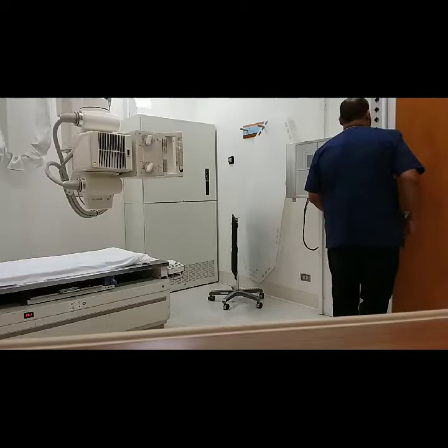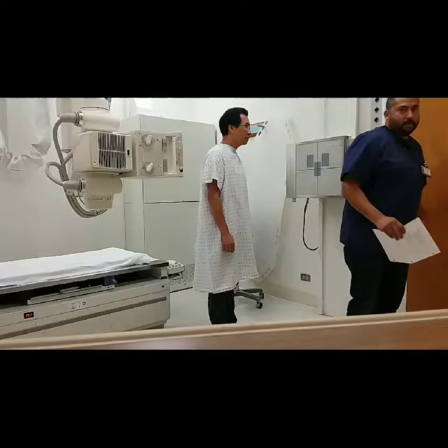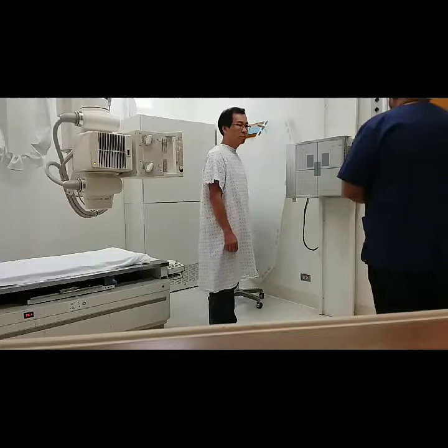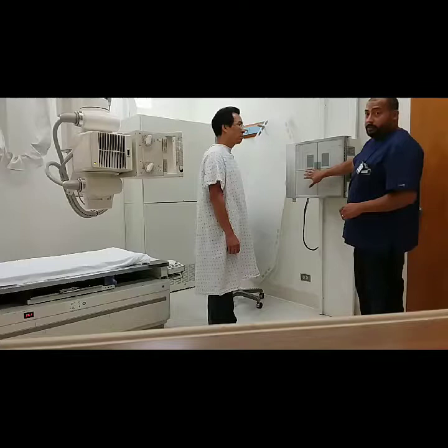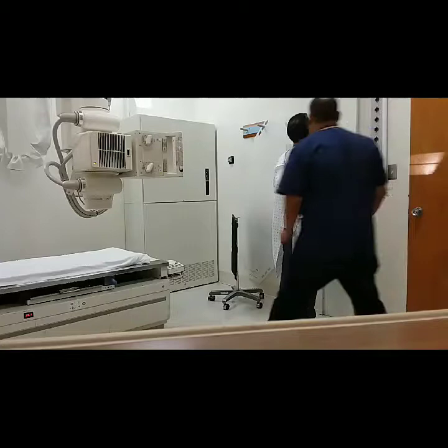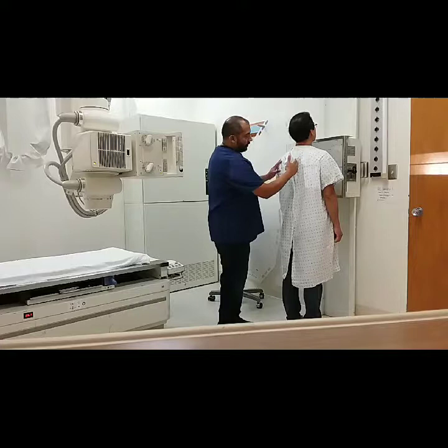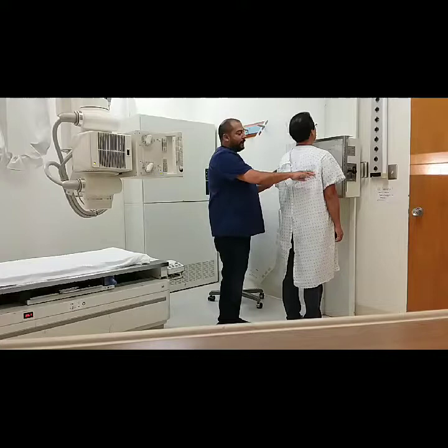I'm going to check on our patient to make sure he's okay. I'll ask our patient to face the wall Bucky IR. What I'm looking for is my center beam — I'll have him move slightly so he's more midsagittal. I'm looking for his T7, which corresponds to the inferior angle of the scapula.